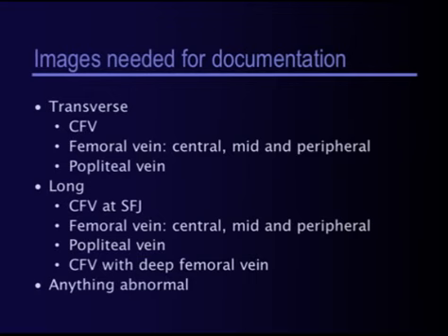Okay, so there's a difference in what is evaluated and what images are obtained. We routinely compress every centimeter down the length of the veins being examined. However, we only take representative pictures for documentation.